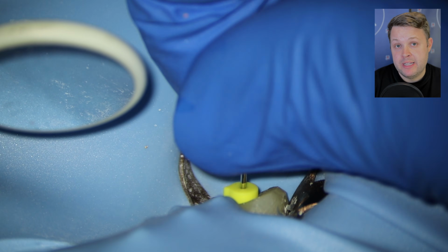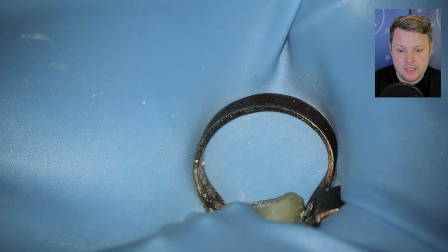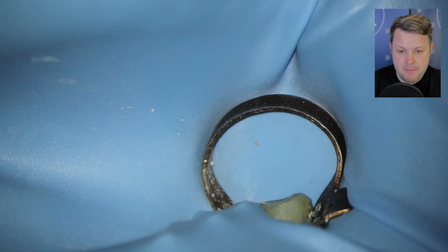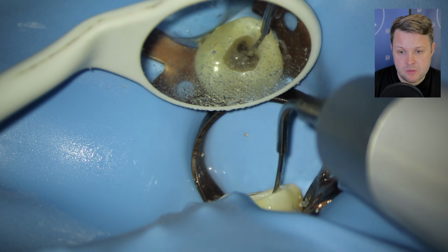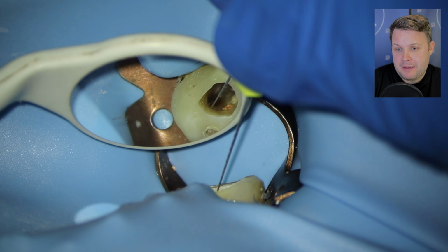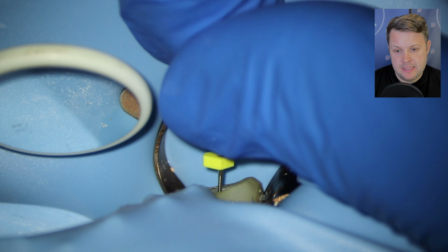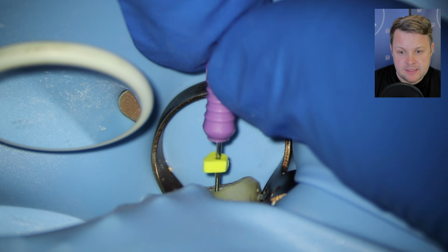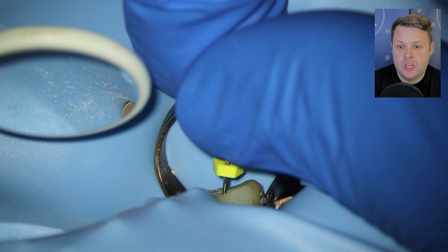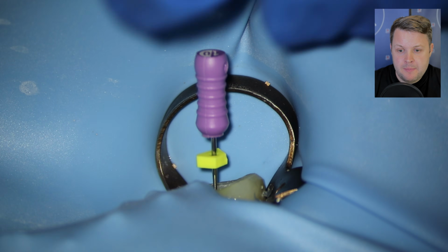And also, what's a really, really important thing to do is to activate your irrigant, especially with GP. Sometimes this can vibrate the GP out of the canal space and help you negotiate. And then, I feel like I've pulled out a lot of GP, maybe I'll get to the end, but we get the D-finder, a little bend at the end, and I'm just very, very slowly negotiating, and I just cannot reach zero with my apex locator.